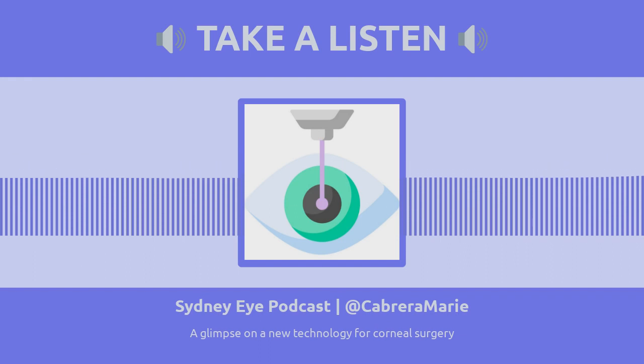Yeah, so I think I'll just take the listeners back to basic sciences and how this technology works. My disclaimer, we haven't used this technology on humans yet, but we use it on several different models. Obviously, hopefully we'll move into humans eventually. So how this technology works, it primarily is made of a polysaccharide called chitosan. Chitosan is a repeating monomer of sugar. Other examples of polysaccharides include starch, glycogen, and cellulose, the cell wall. So essentially it's a biocompatible molecule. You're making all these sugar molecules join together to form a rigid structure. So that's chitosan in the really, really basic form.